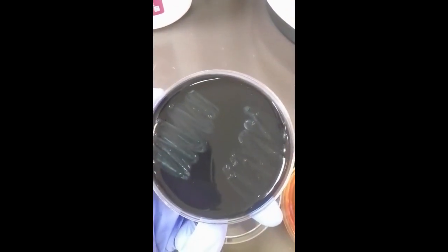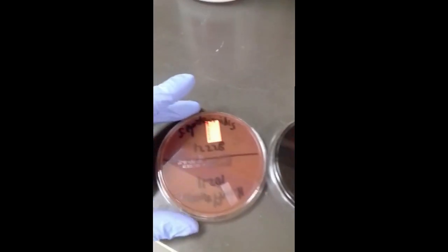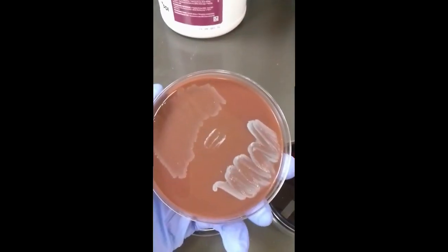The reason this is important is because specifically for your fastidious bugs, for example, Legionella, Haemophilus, you definitely need your media to be cooperative and viable in order to pick up those bugs, because something like Legionella species is not going to grow on anything other than your BCYE plate. So you really need that plate to make sure it was manufactured properly and it's working as intended.